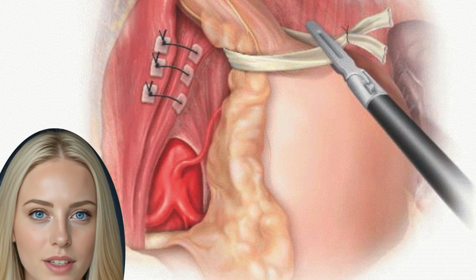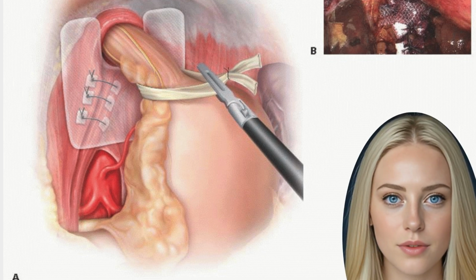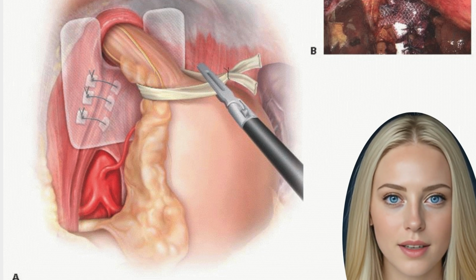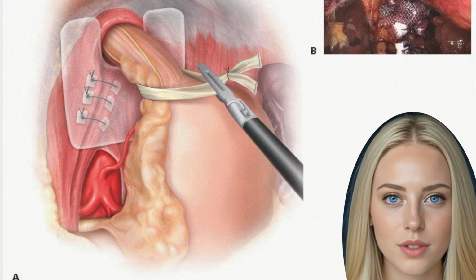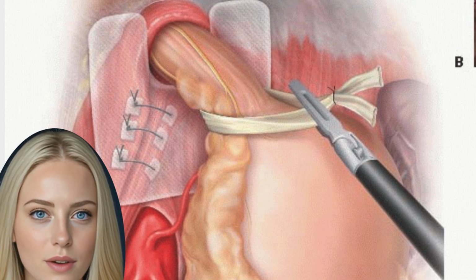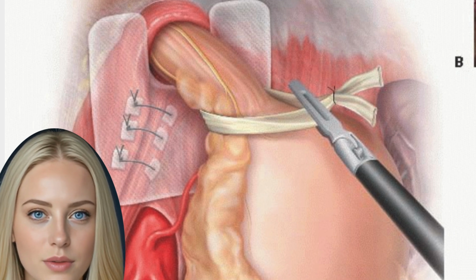Posterior gastric attachments are divided to complete the circular dissection. The surgeon's left hand and assistant splay the stomach in the anteromedial direction and the omentum to the left. This reveals attachments posteriorly from the splenic vessels to the left gastroepiploic vessels. These can be taken also with ultrasonic dissection. After reduction of the posterior sac, Figure 11, this completes the 360-degree mobilization, Figure 12. A Penrose drain can encircle the GEJ for atraumatic retraction.